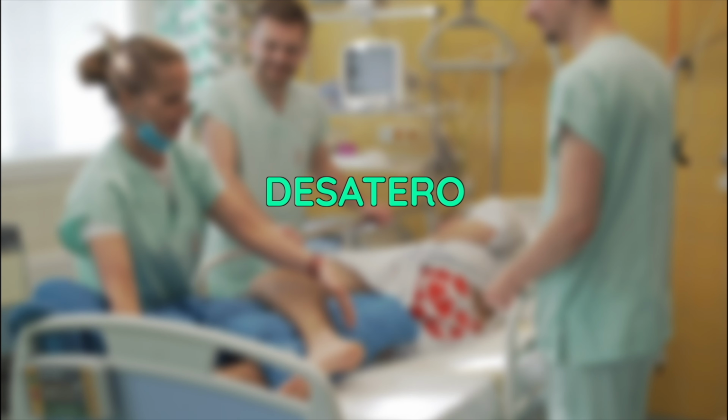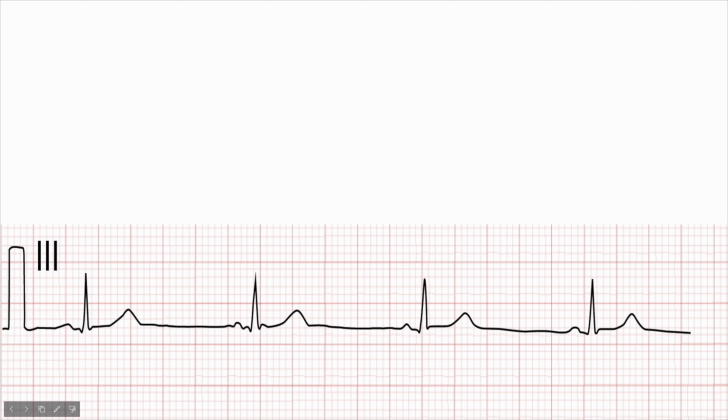When interpreting an EKG, we follow the 10 commandments that evaluate, firstly, the regularity of the heart action, whether it is regular or not.